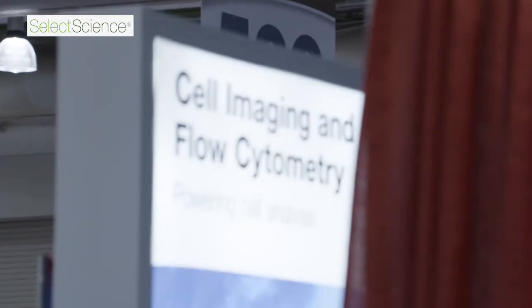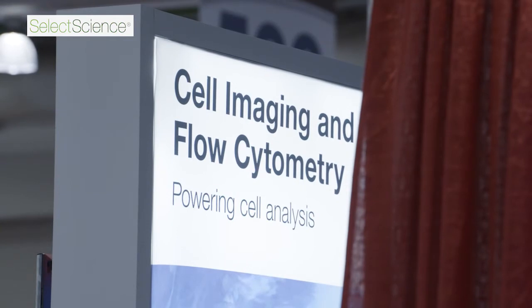When a patient has a severe infection, using the correct antibiotic is very, very essential in terms of whether or not that patient will survive the infection. Antibiotic resistance is rapidly increasing within the community, and it's a case in which bacteria are no longer susceptible to the commonly used drugs. So we need to be able to identify that very rapidly. We've been using flow cytometry to speed up the process.